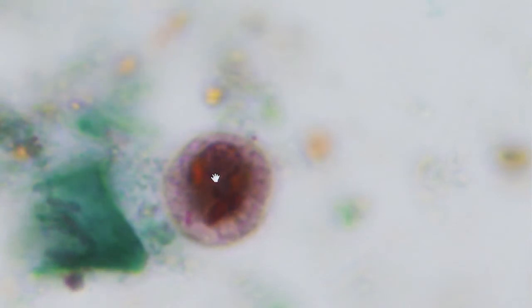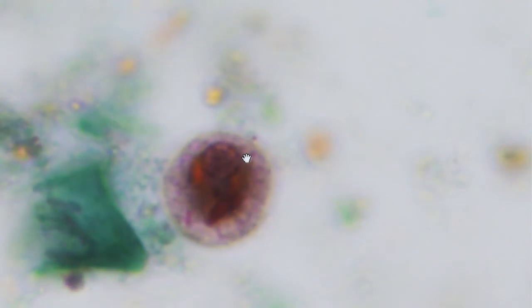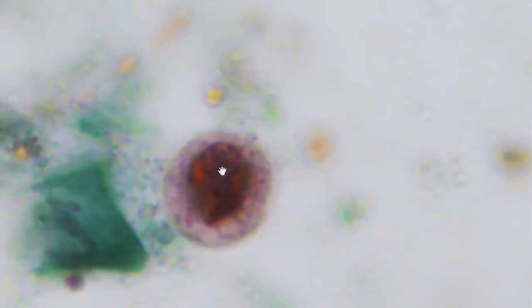Big nucleus, takes up almost 1/3 of this cyst. A uninucleate cyst, and the cysts of these particular Entamoebas are normally uninucleate and very occasionally binucleate. It has quite blotchy peripheral chromatin and an eccentric but quite large karyosome, and a lot of chromatoid bars of funny shapes, lots of funny sickle shapes, and a lot of those chromatoid bars.